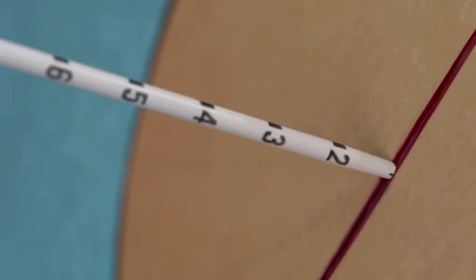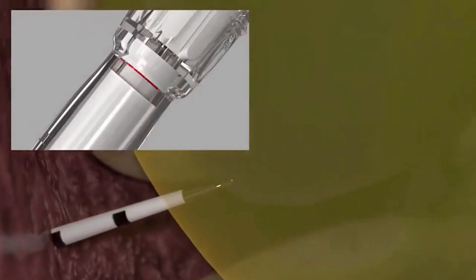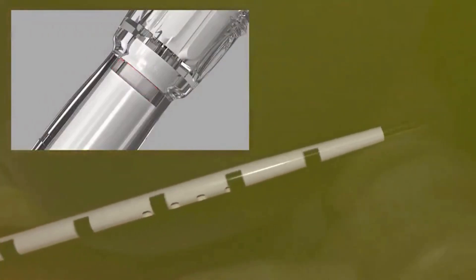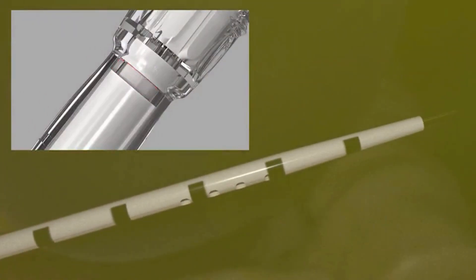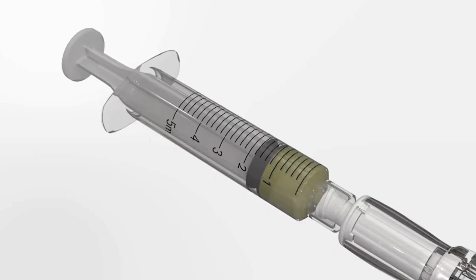Advance the Safety Centesis device into the desired cavity. Centimeter depth markings on the catheter shaft can help confirm accurate placement. As the needle tip enters the free cavity, the color change indicator should transition back from caution red to safe white. Use the pre-attached syringe to aspirate fluid and confirm positive placement.